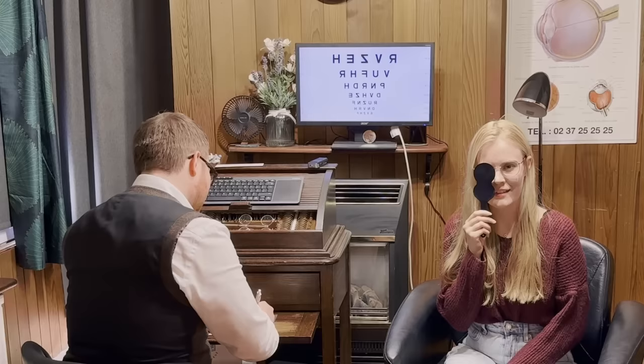So the second line up from the bottom is actually the 20/20 vision line. So you're kind of seeing a line better than that. So that's why it is a bit of a struggle. But no, that's excellent. Now, if I could just borrow the cover there.